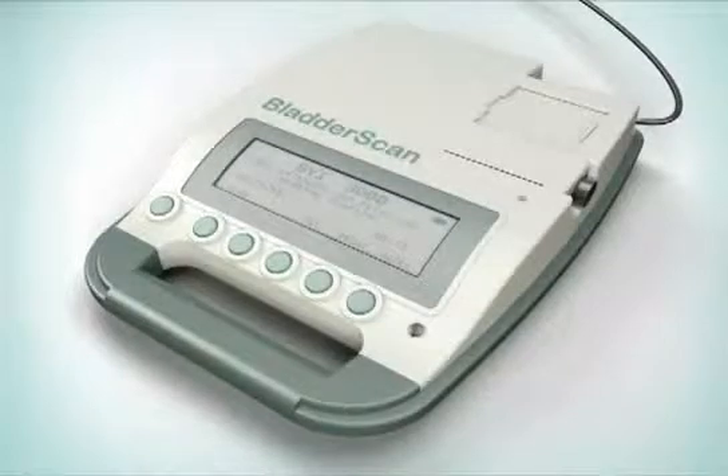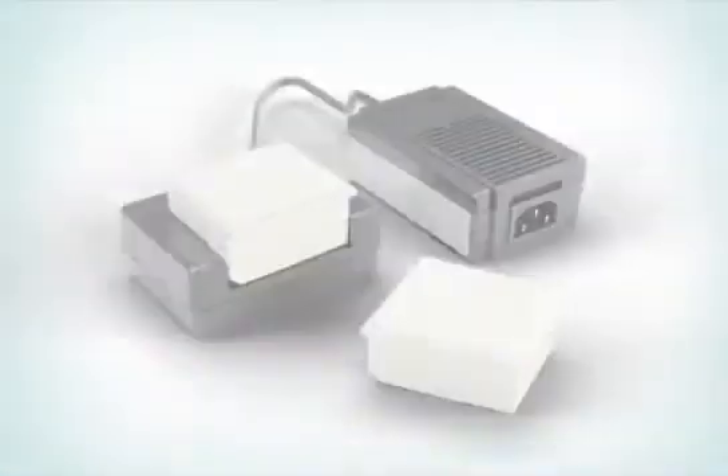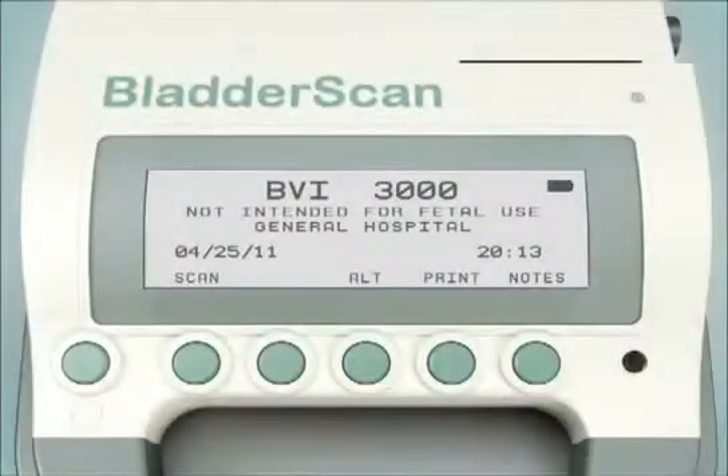The BVI3000 consists of a battery-operated LCD display console, an ultrasound probe that scans the patient's bladder, and a pair of rechargeable batteries with a charger. The BladderScan BVI3000 is designed to scan in two patient-specific modes.